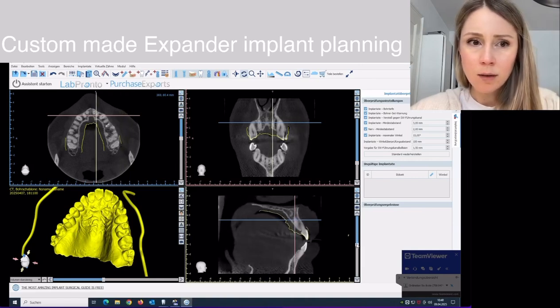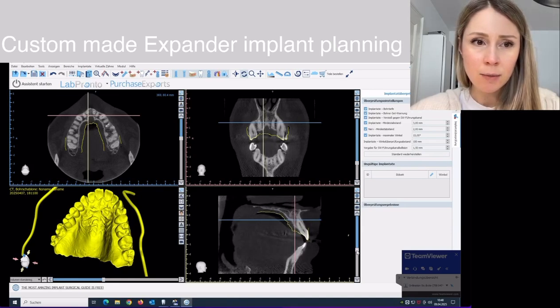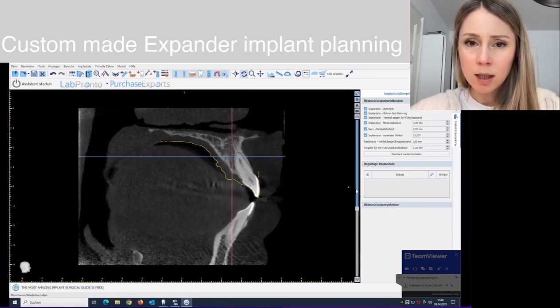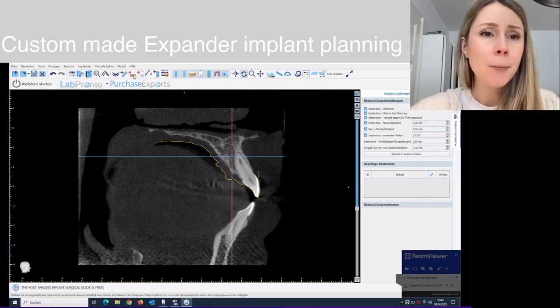Here I'm going, okay. So if you look at the yellow line here, we are right in the middle between the incisors. Here is the foramen, and I want to go slightly lateral to the foramen, between the roots of the central and the lateral. Okay, I'm going to make that big here. This is actually a great position. Here the bumps are the rugae, so I'll try to place it behind that rugae.